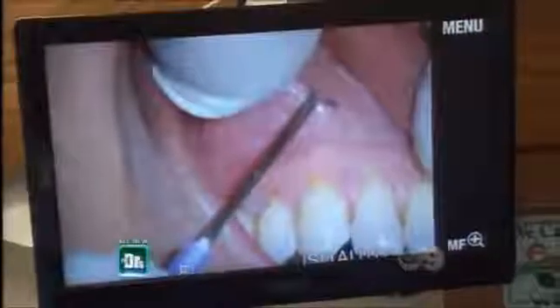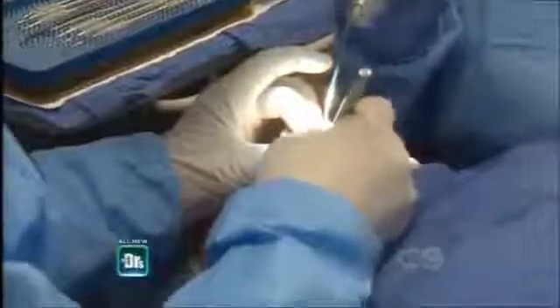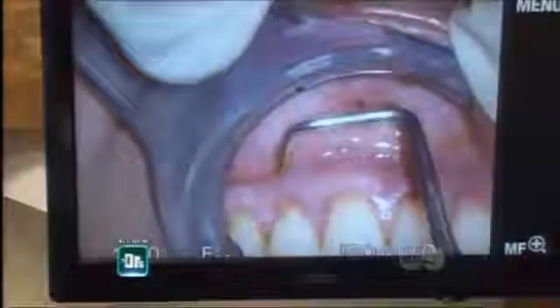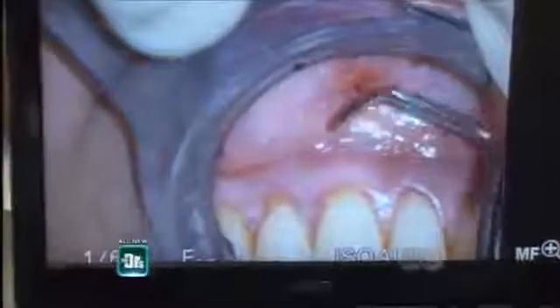We're about to start the procedure with a pinhole right at this point on number 6. And this is the instrument that I use to go through the pinhole. I'm loosening the gum from the attachments to the bone underneath and to the root underneath. I'm just kind of gliding it down. Now I'm going to move to another tooth. Now I'm using a longer instrument so that I can reach Rocio's back teeth.